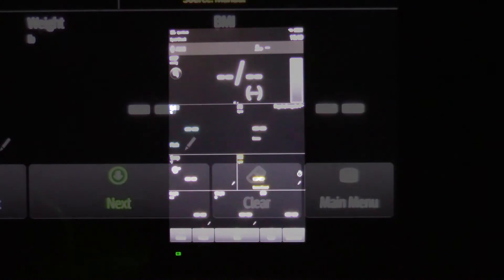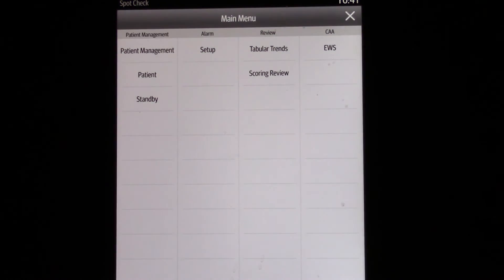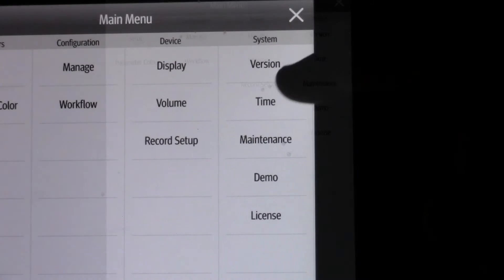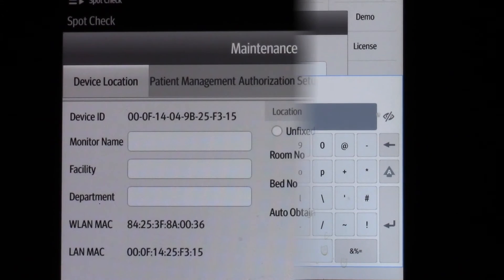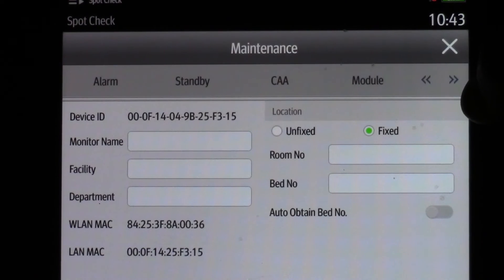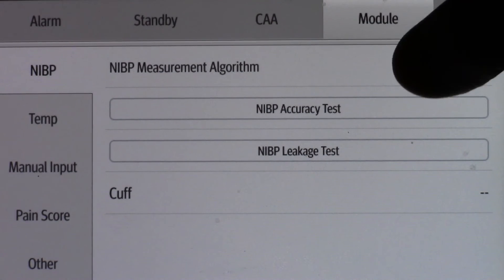Once at zero, go to the monitor screen and select Main Menu. Swipe left to right and select Maintenance. Enter the password or contact tech support for assistance. Navigate and select Module. Under NIBP, select NIBP Accuracy Test.